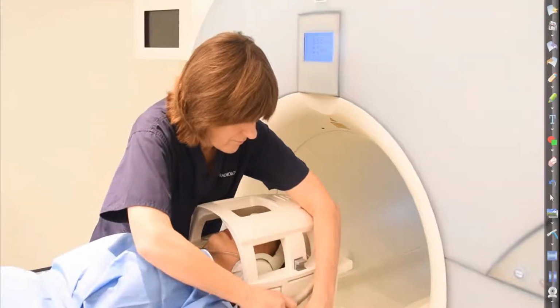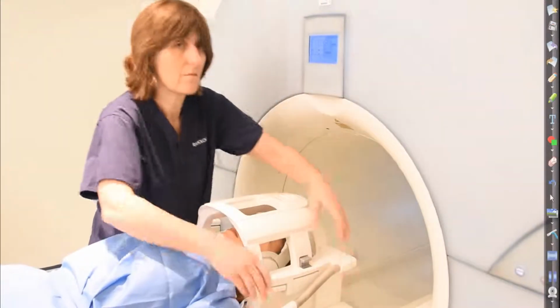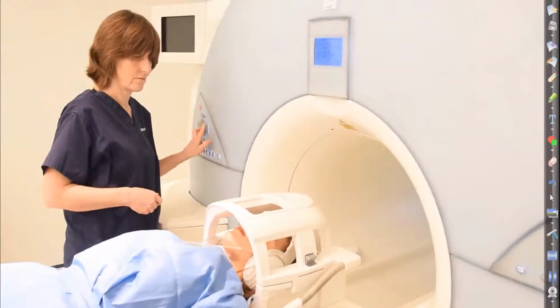See how they're plugging those coils into the bed. It's important. Otherwise, you're not going to get any signal from those coils.